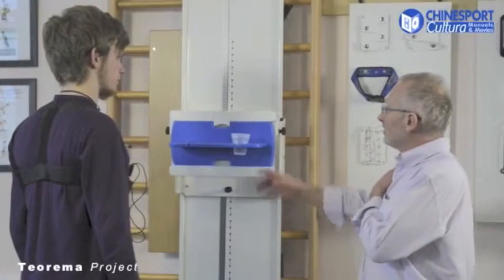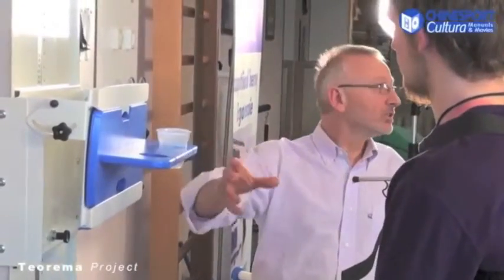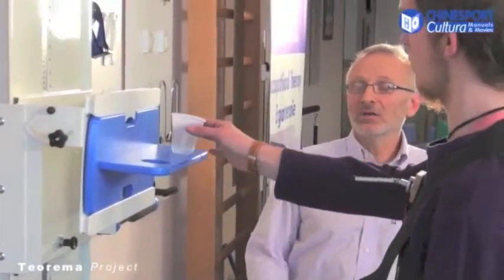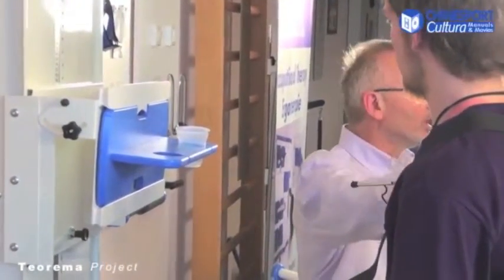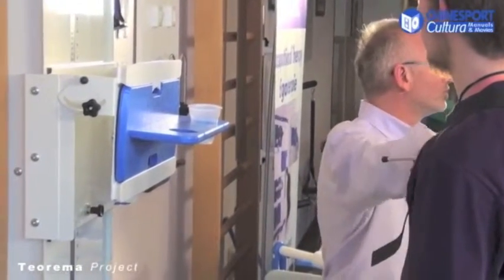In this case, for movements that involve a task up to a certain height, we do not take into consideration the fact that the trunk can act within the movement. The trunk must act as a stabilizing element. Therefore, as soon as the patient takes a compensatory action while making this movement on the sagittal plane, we have identified their problem, which is not being able to stabilize the trunk and not managing to use the joint in an adequate manner.